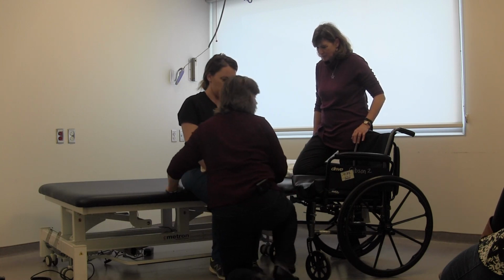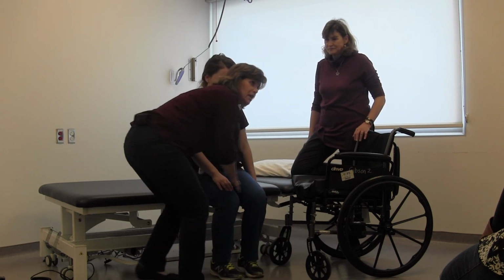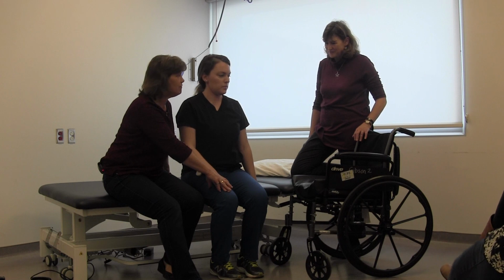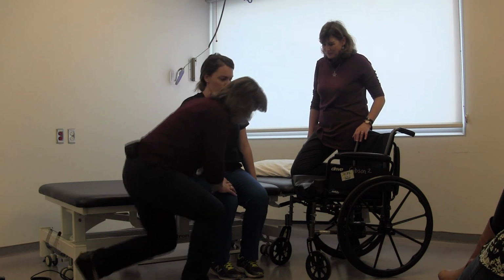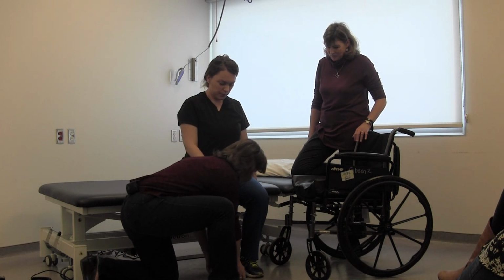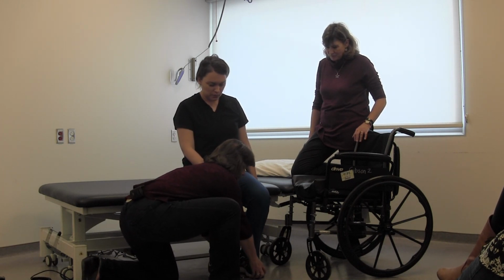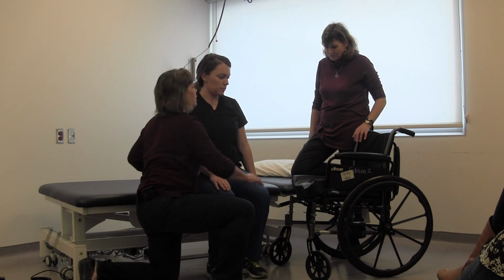Okay, now the only thing is some of our beds, the edges are pretty soft, so you have to make a good judgment. If you bring them too close to a soft bed, they can slide right off. Okay, so you have to be careful of that. Then we're going to set up her feet, so her heel is off here, so I want her heel flat. Okay, and we want that one flat, okay?